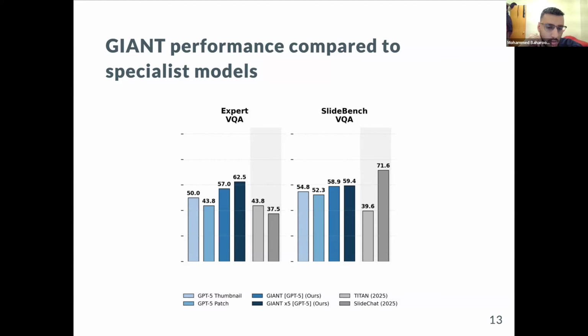That's weird. I would have thought there is a bunch, because every now and then I see an open source pathology foundation model being released. Yeah, so Titan is open source, but because the reports include patient information, they were only able to open source the embedding model, so you can't use it for report generation.